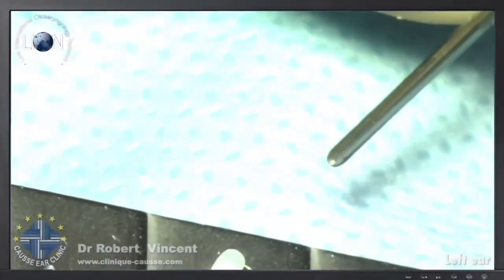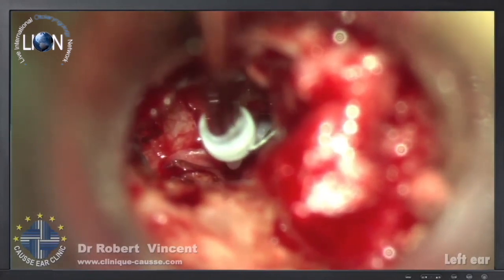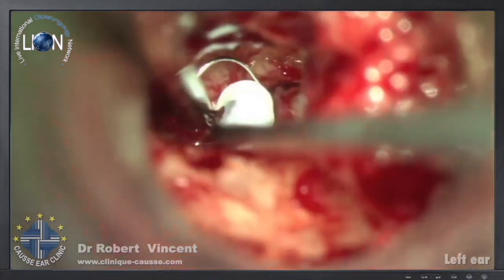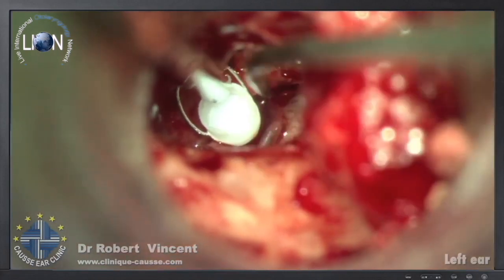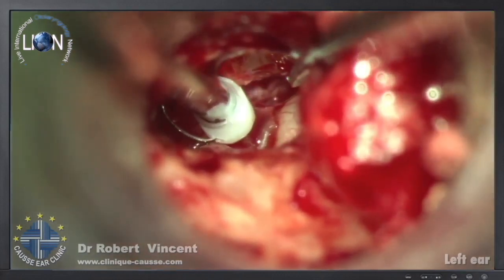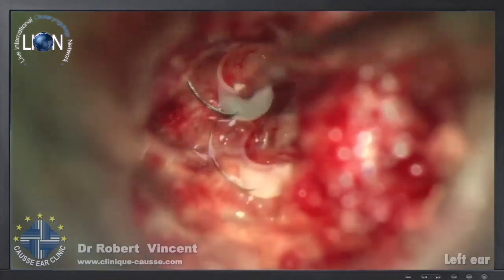I'm going to introduce this prosthesis with the sucker, like this. And this will be placed underneath the lenticular process, so I'll be away from the facial nerve compared to a loop of the piston. So I'm introducing now the shaft in the same way. And then I will slightly elevate the incus, pull the incus a little bit and very gently. But first I need to place the anterior part of the prosthesis head in front of the lenticular process like this, and then just put the hollow head underneath the lenticular process.